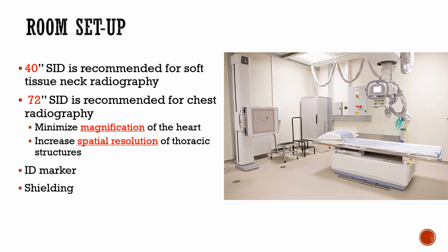We always use our ID marker for all images, and then we also shield for both the soft tissue neck and the chest radiography procedures.